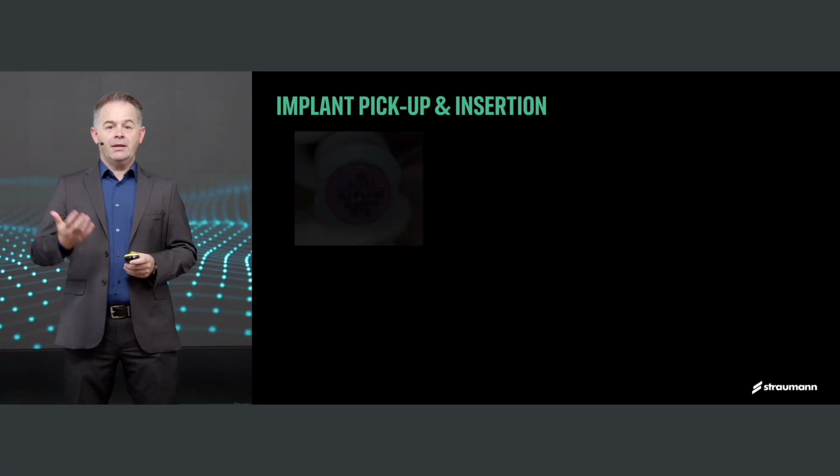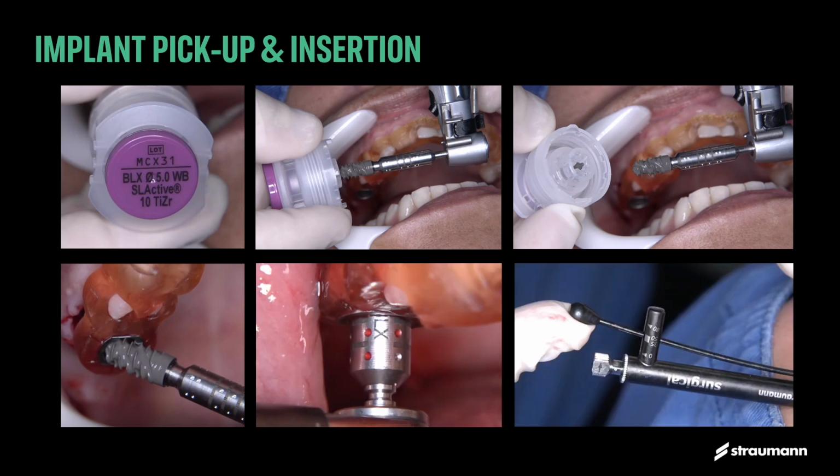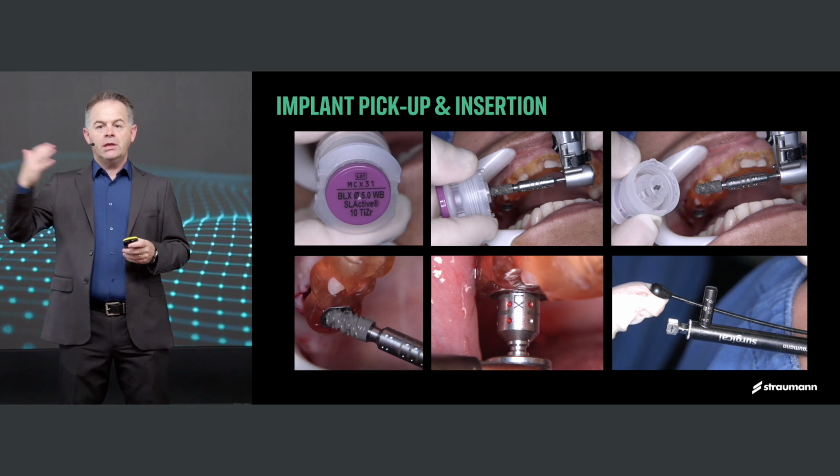Then it's time to place the implant. I did the pickup with the implant driver for guided surgery, exactly at the mark that was predefined in the planning. You can see that we reached 35 to 50 newtons. I was very happy then to continue with the procedure.